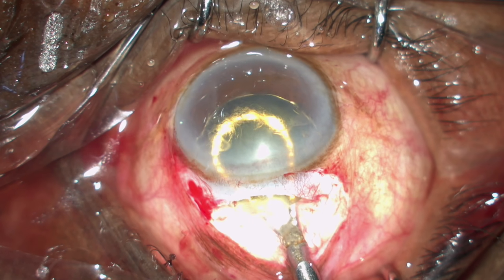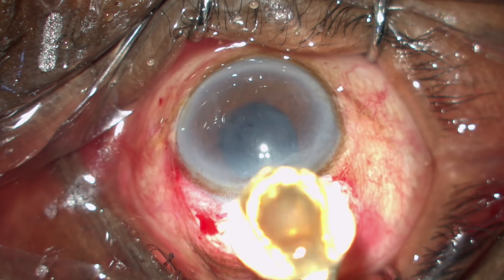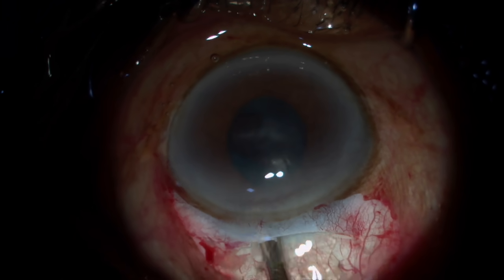While bringing it out, make sure that you depress the lip rather than pulling it. The epinucleus can be brought out by just slow depression of the tunnel.